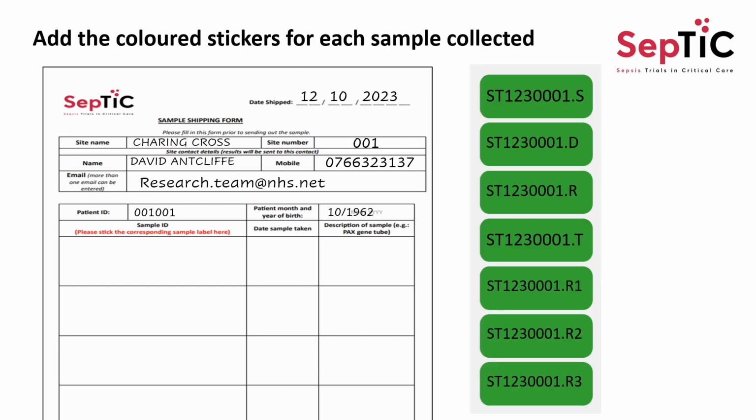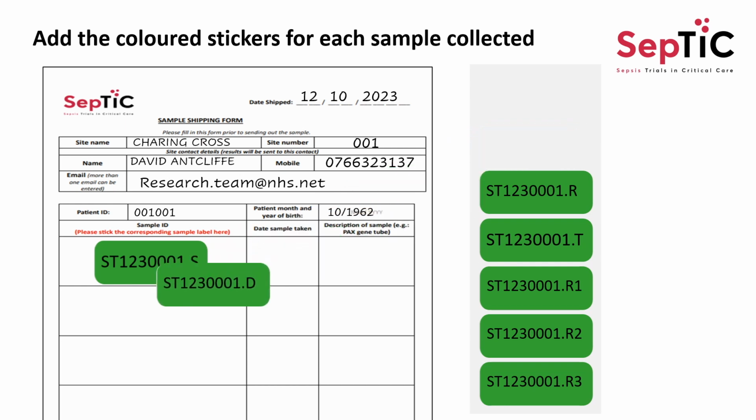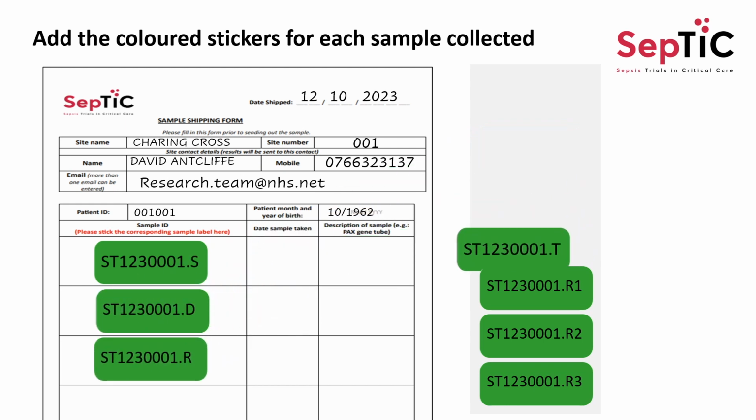Once this has been completed, you will need the strip of coloured non-barcoded labels. And one label should be placed on the form for every sample that has been collected. For the first sample collection, this will leave you with 3 unused labels, again labelled R1, R2 and R3. As with the barcoded labels, these should be retained in case your patient is randomised into the GM-CSF domain of the trial.